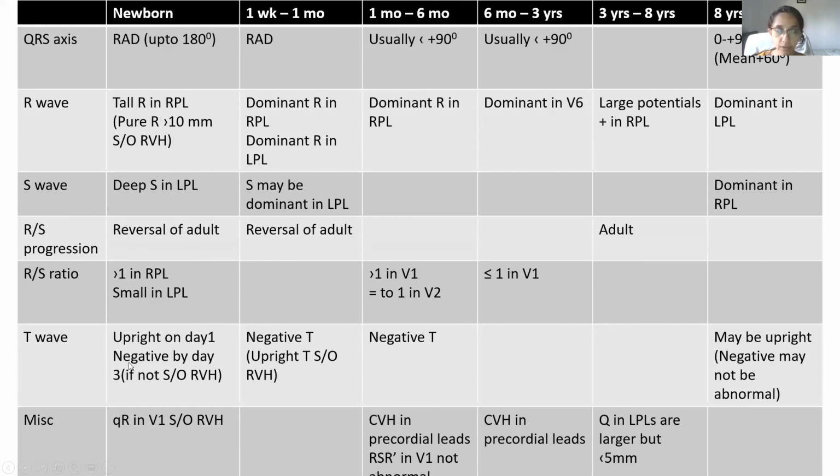The T wave, we know that it should be upright for the first 3 days. It becomes negative and it again becomes positive anytime between 3 to 8 years of age. Yes, so I think this is the summary of all the understanding we had in the last few slides.